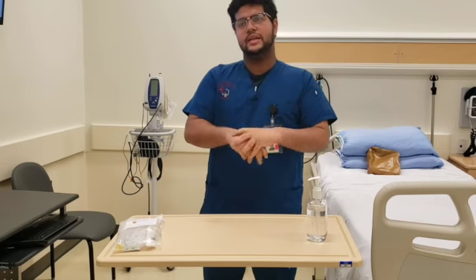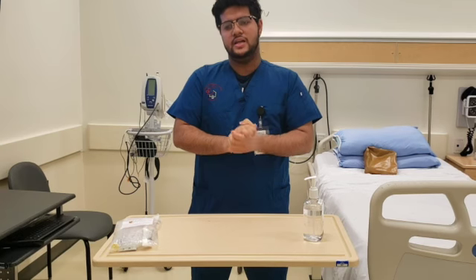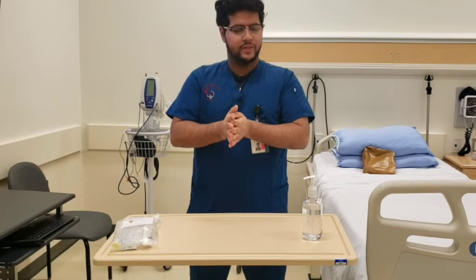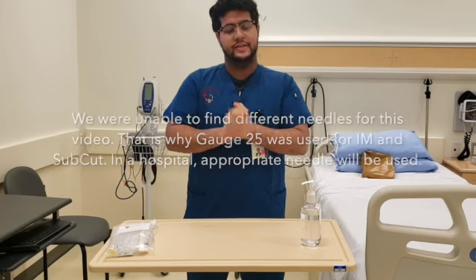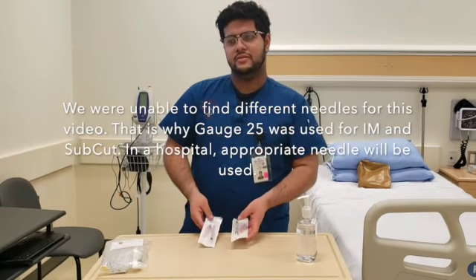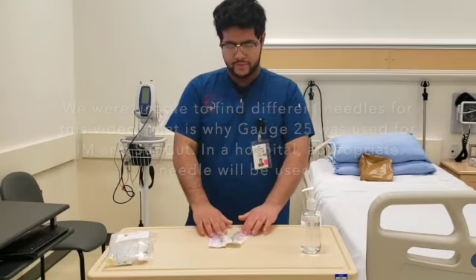The subcutaneous gauge will be between 25 to 27, and the needle length will be 3/8 to 5/8 inch. For intramuscular, the gauge is going to be between 22 to 25, and the needle length is going to be 1 inch to 1.5 inch. And these are our 2 needles that we'll be using.